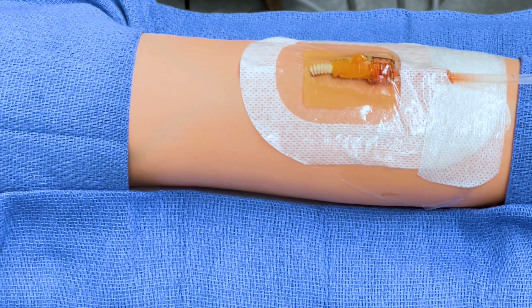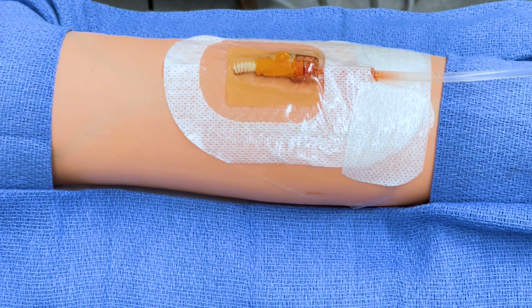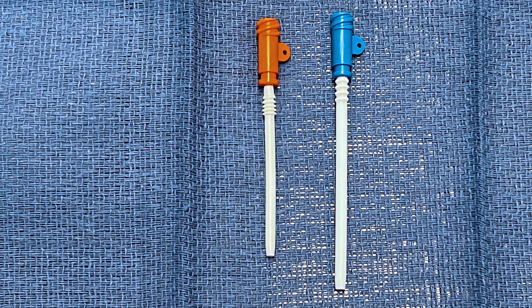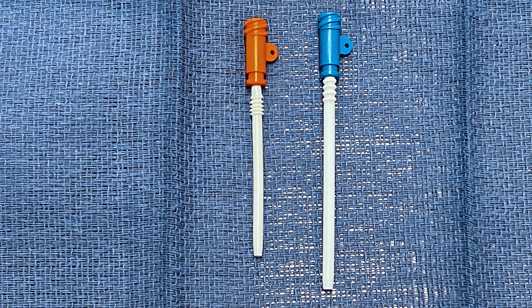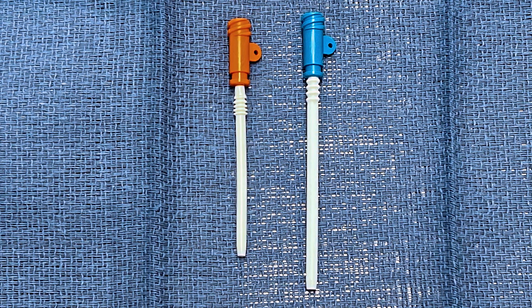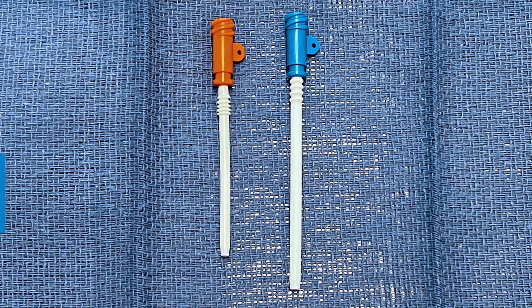In this video, I'm going to demonstrate how to place a large-bore rapid infusion IV catheter, followed by a brief discussion of the common pitfalls of the procedure. Aero rapid infusion catheters, or RIC lines, are a product line of very large-bore peripheral intravenous catheters designed to be placed easily and rapidly in trauma or other large-volume hemorrhage situations.